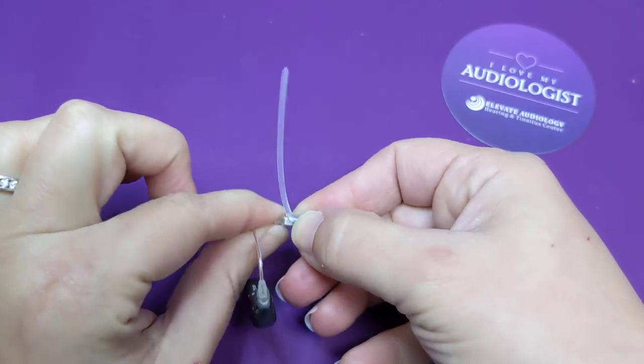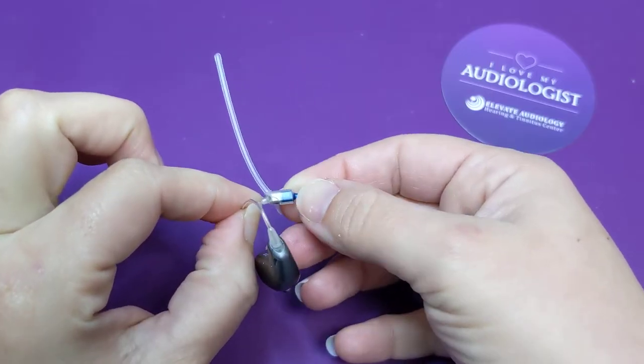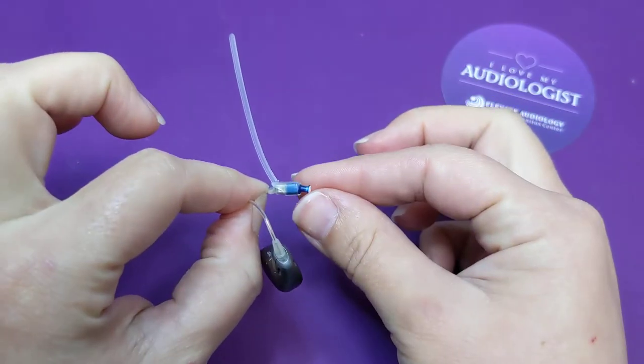So this just slides right on there until it catches right on the end. And then you would put the dome.